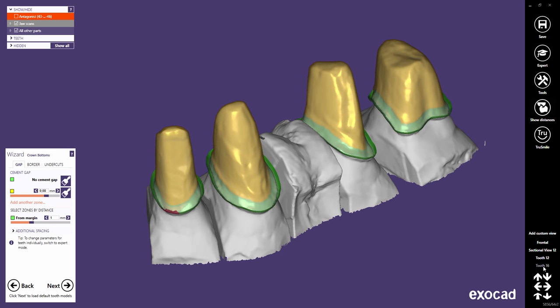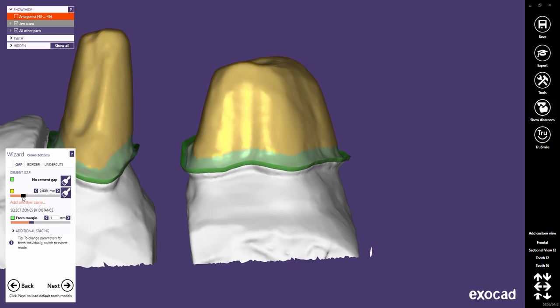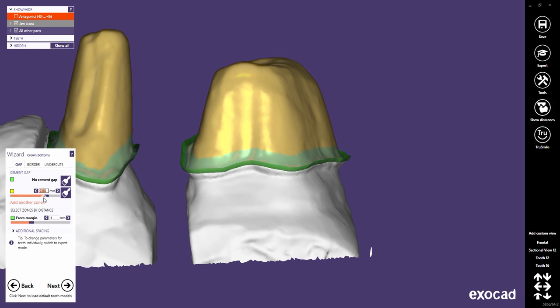Let's choose a custom view for tooth 16 to show the main cement gap parameters. The yellow area is the cement gap zone. It can be adjusted with the cement gap slider, and as you can see, the new cement gap is computed in real time.